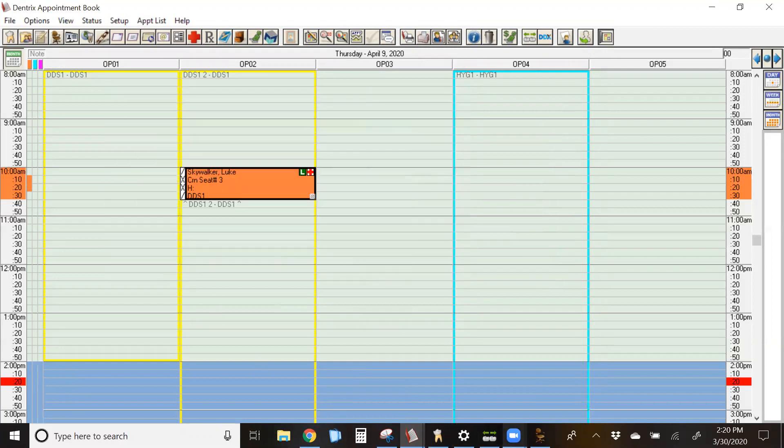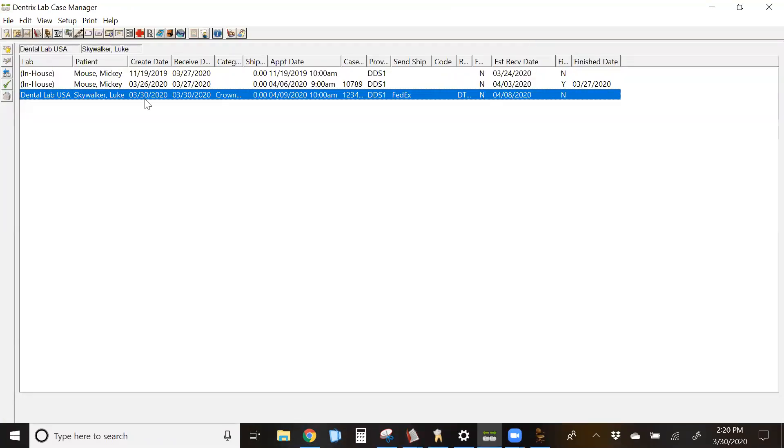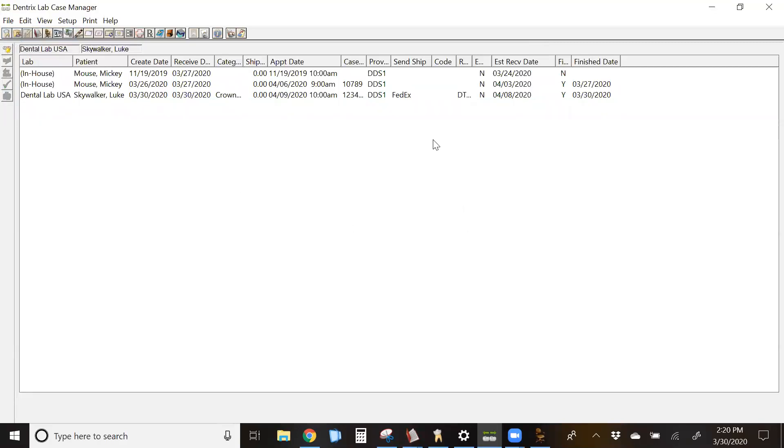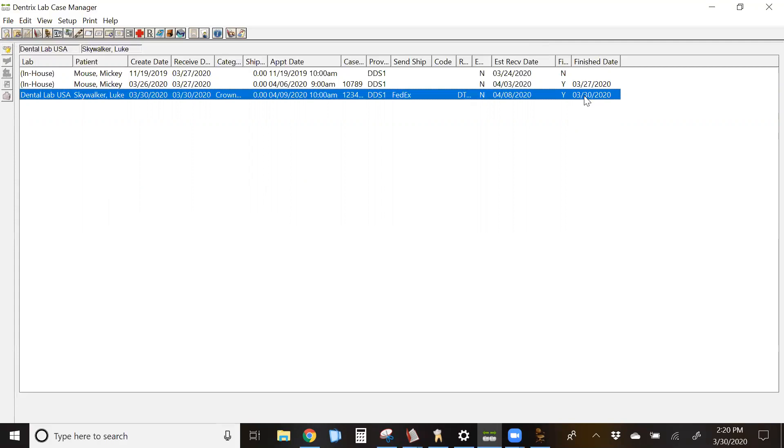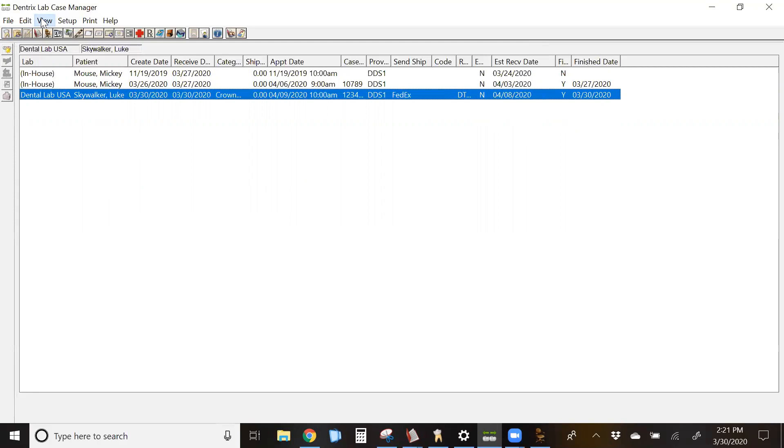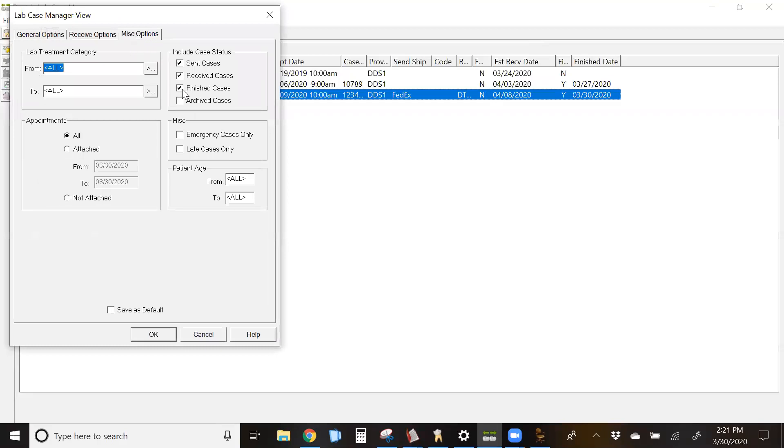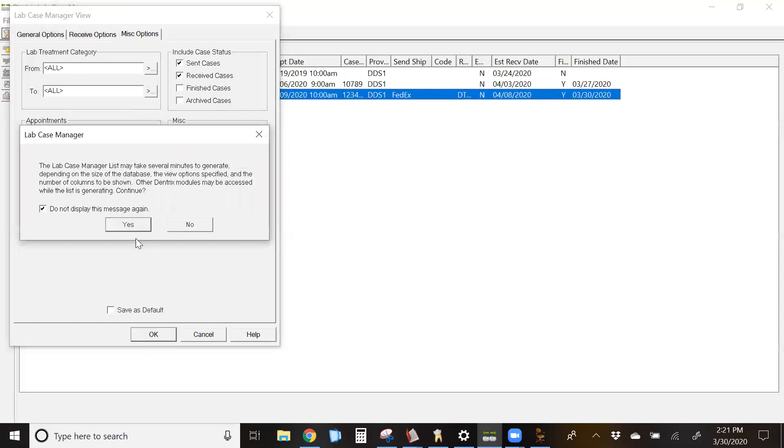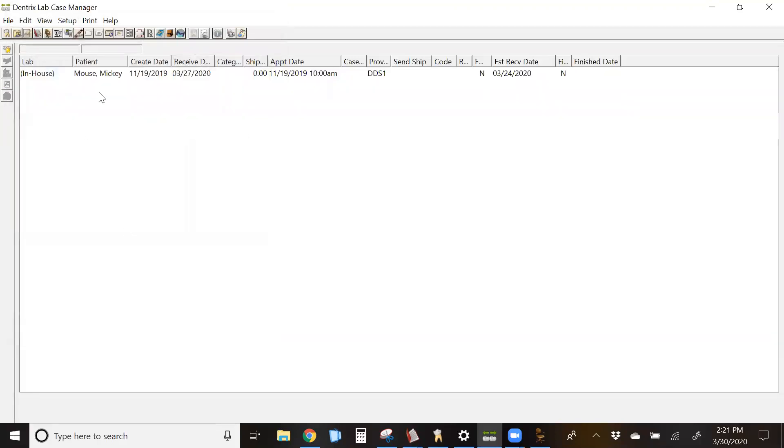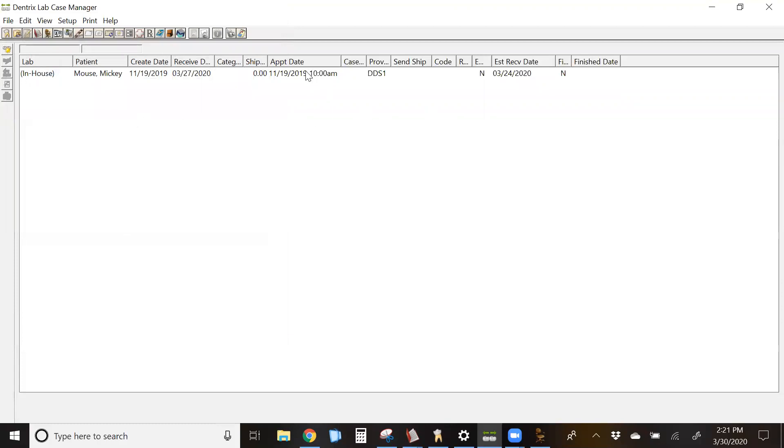Now, when we go back to our lab case manager, I'm going to refresh it. You're going to see a finish date in this column over here. So this case has been completed. It was received and it was finished. Now, remember how we talked about the view for the lab cases? You don't have to look at all of those cases when you're loading this. More than likely, by default, you will take finished cases off of this list. That way, you're only viewing active pending cases.